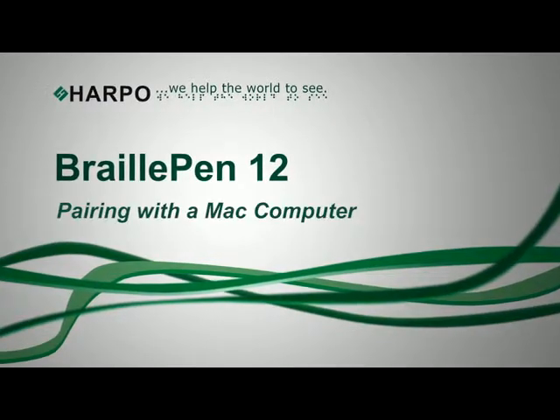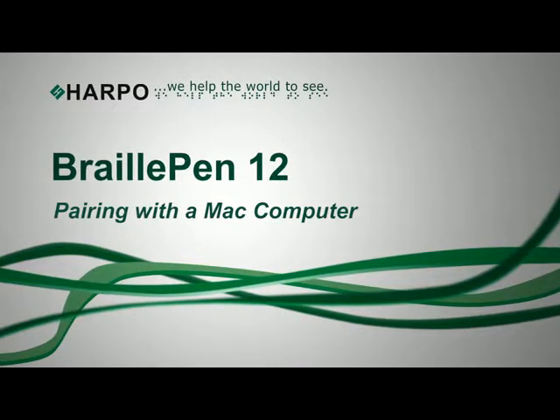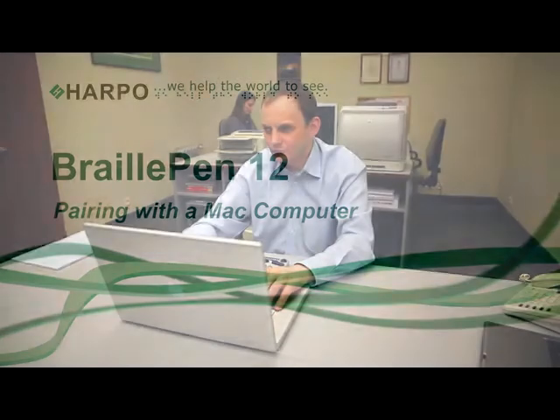Braille Pen 12: Pairing with a Mac computer. As with VoiceOver on an iDevice, you can pair the Braille Pen 12 with a Mac computer while VoiceOver is running, and it must be running before the Braille Pen 12 will connect.